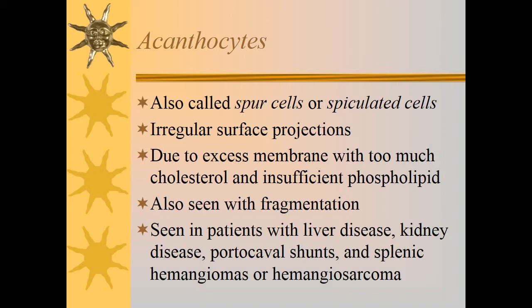They should not be confused with echinocytes, also known as burr cells. Echinocytes are crenated red blood cells that have projections which are evenly distributed around the cell.